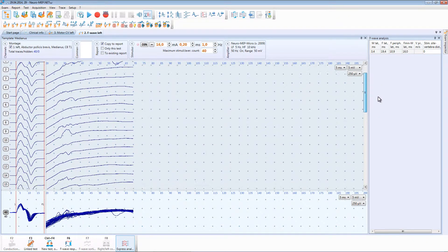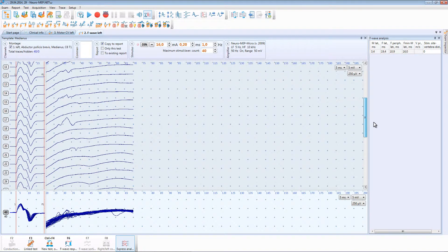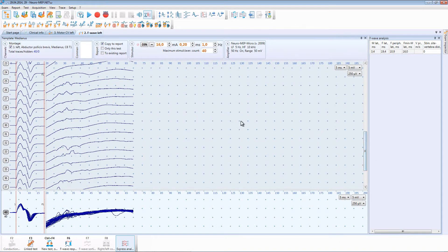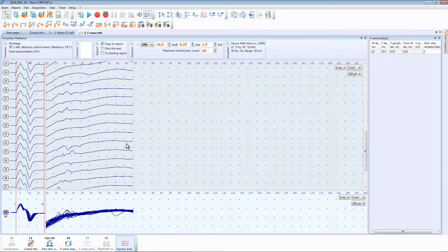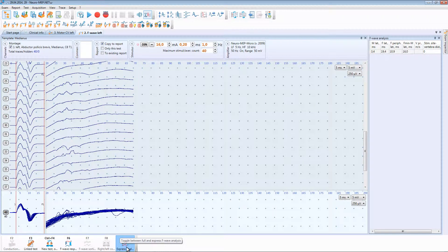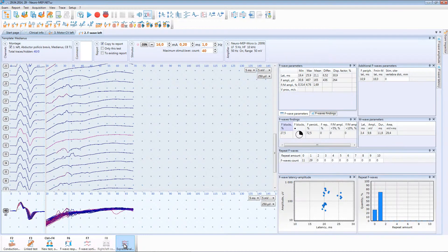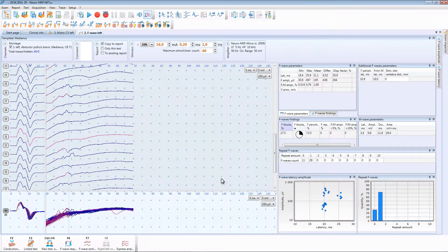As a rule software places these markers accurately. This test provides the opportunity to perform express analysis of the F-wave. The express analysis mode is active by default. If you want to get access to the advanced features of the software use button located at the bottom part of the screen.